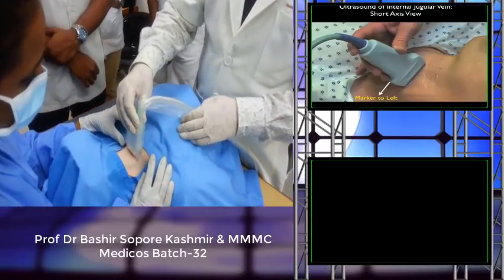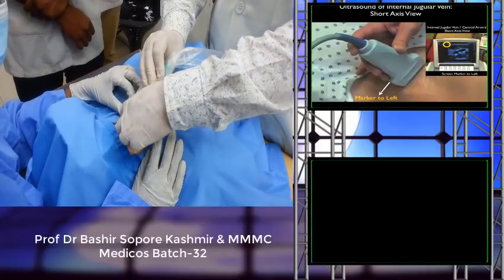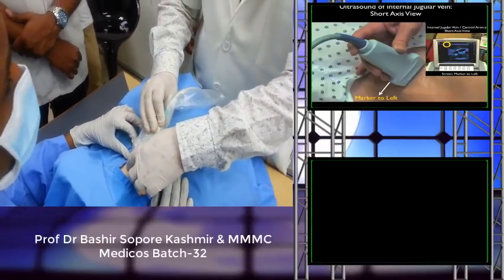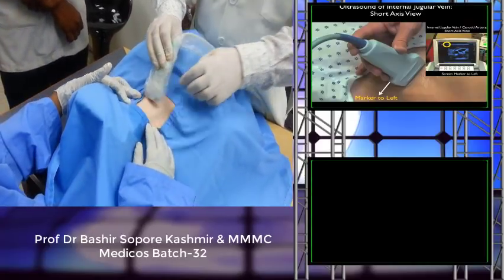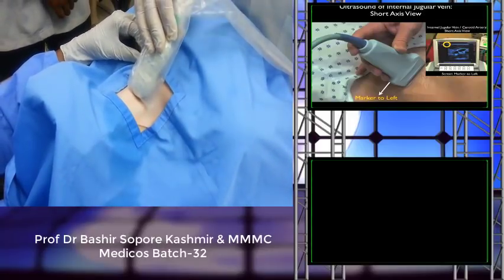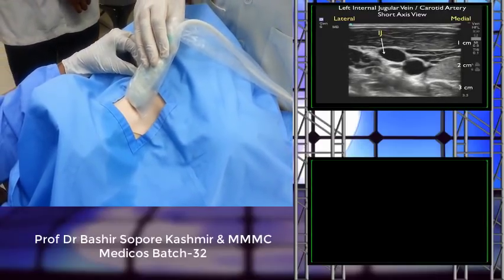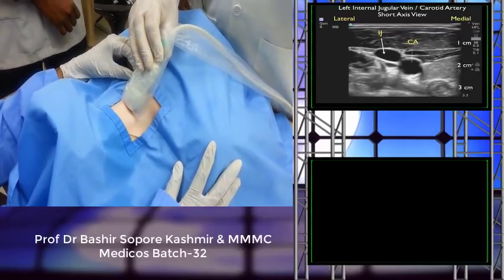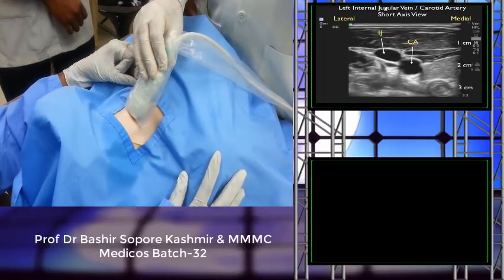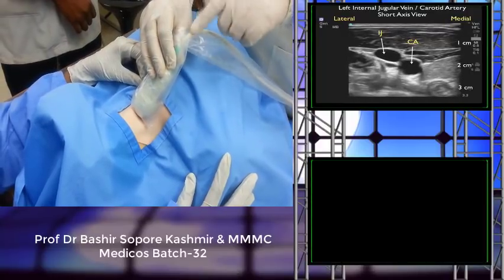When we put the transducer like this, it is called short axis. We put it at the area we know as the apex. When the two ends of the sternocleidomastoid muscle meet, that is the apex. So we keep it here, for example, and the image will be displayed on the screen. This is called short axis. In short axis, both the artery and vein are shown on the screen. The vein will appear bigger and superficial. The artery will appear circular.